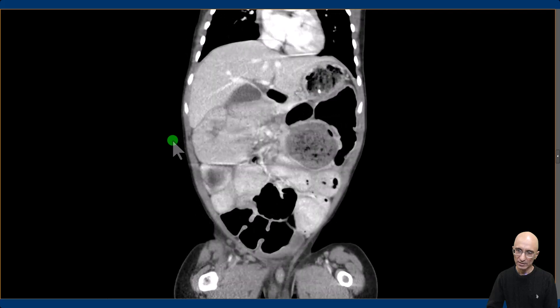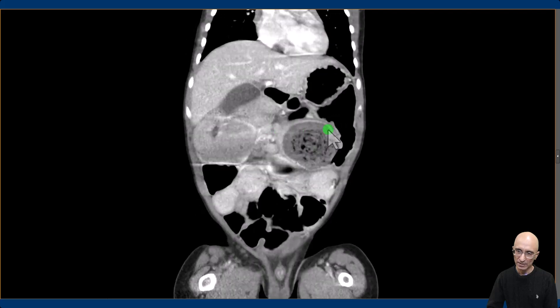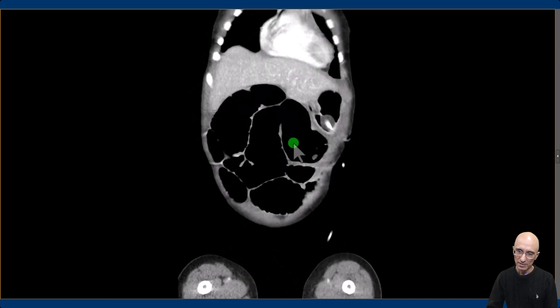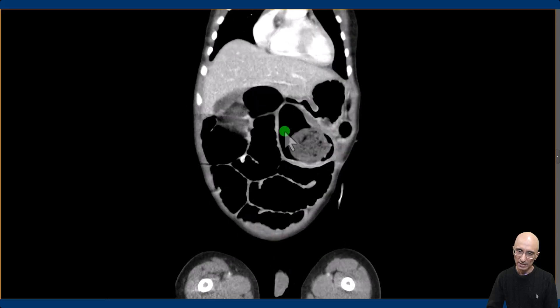We can see similar findings on the coronal images. There is endoluminal particulate material which contains concentric layers of gas. Upstream to that, there are multiple dilated bowel loops.